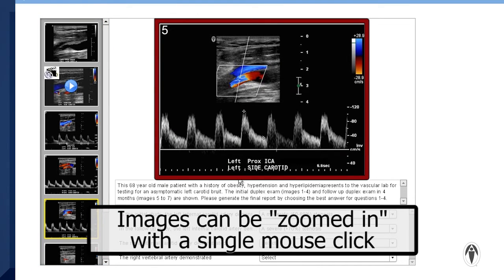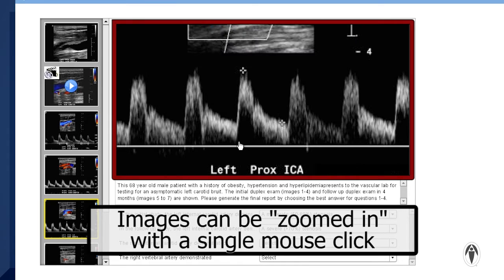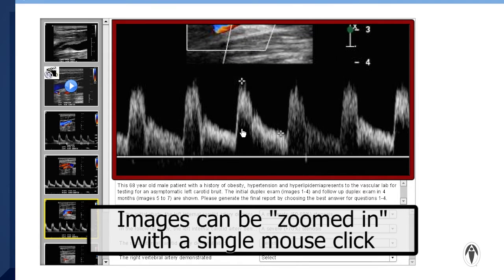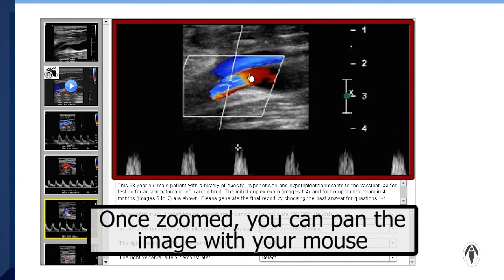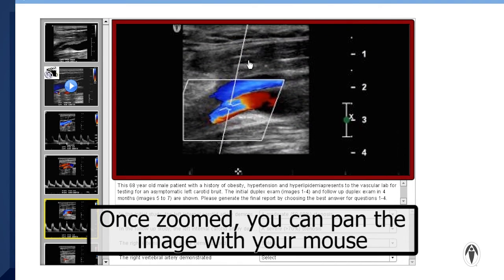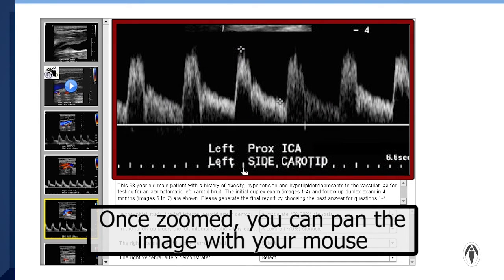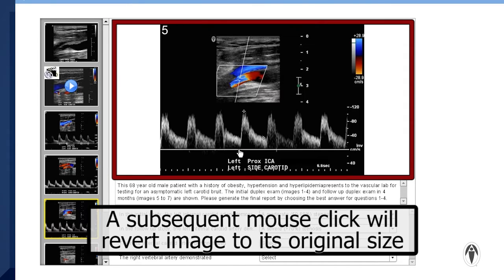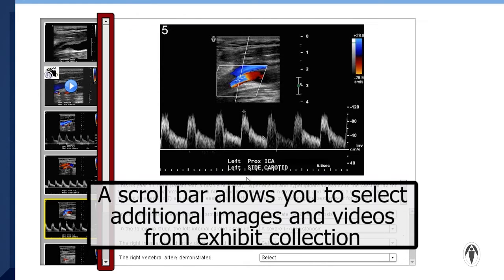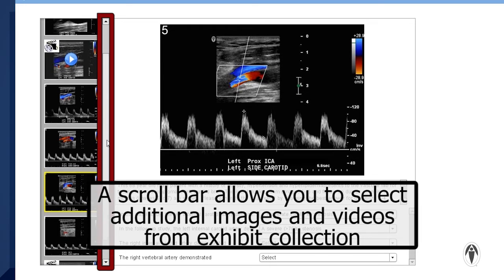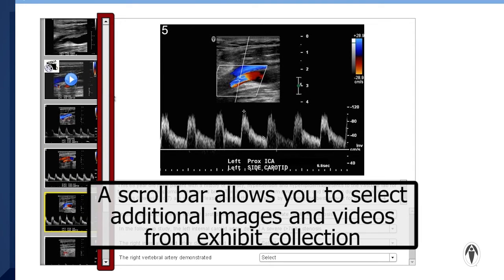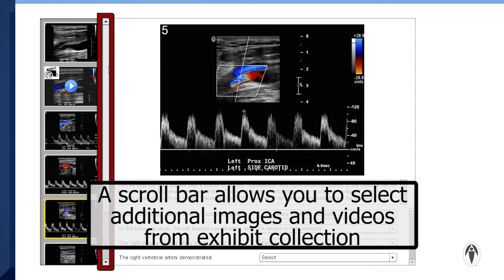Images can be viewed in a zoomed-in version with a single mouse click. Once zoomed, you can pan the image with your mouse. A subsequent mouse click will revert the image to its original size. A scroll bar allows you to select additional images and videos from the exhibit collection.